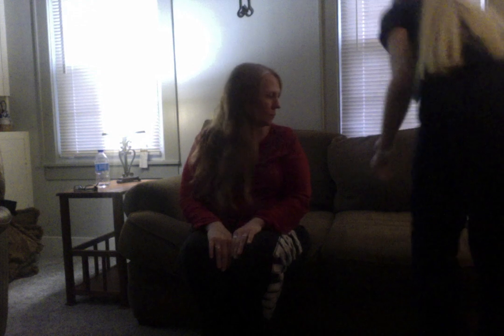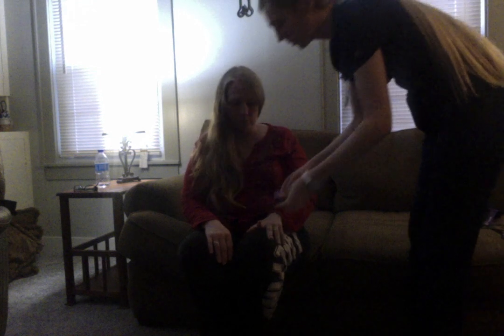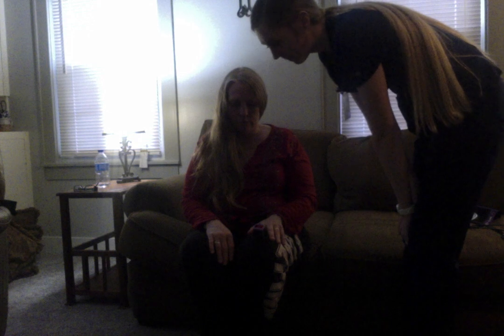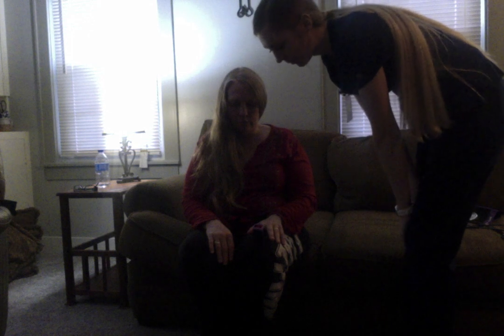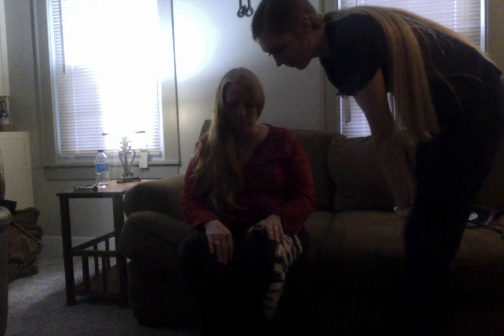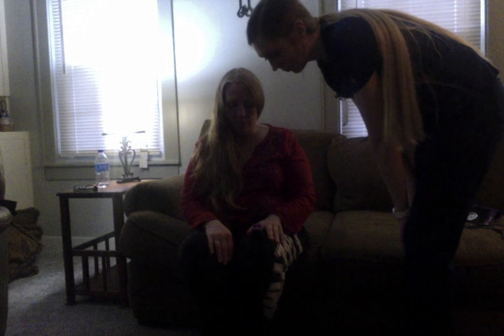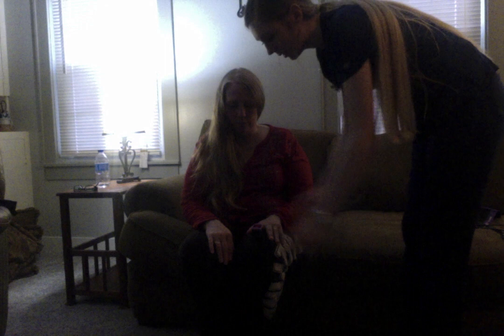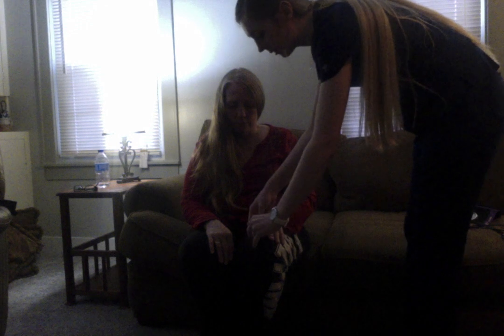So now I'm going to get her pulse oximetry using this little pulse oximeter. And it's going to be 97% on room air.